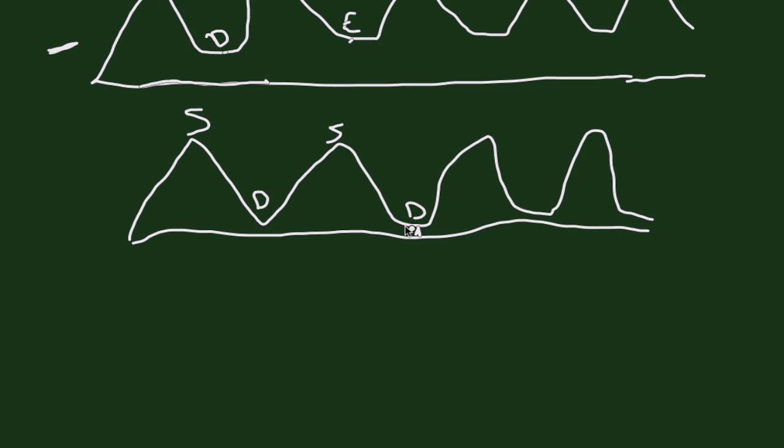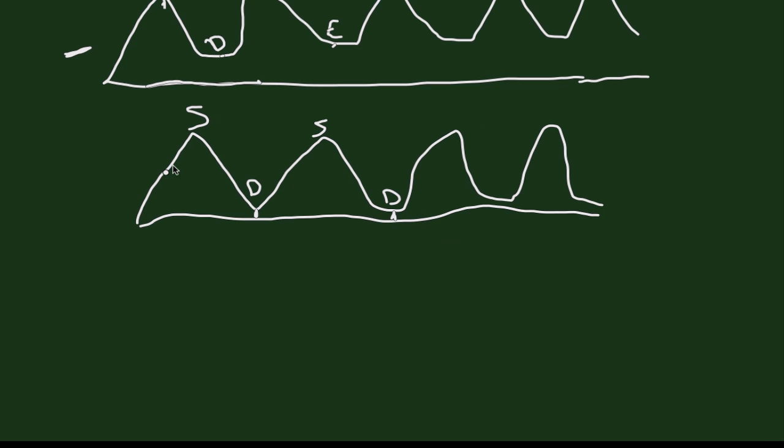And there's much less flow in this image than there was in this image. And what this demonstrates is increased resistance of the placenta, which causes impedance of blood flow from the fetus to the placenta. During cardiac ventricular contraction, systolic flow is usually unchanged. But when diastole occurs with ventricular filling, not as much forward flow occurs.